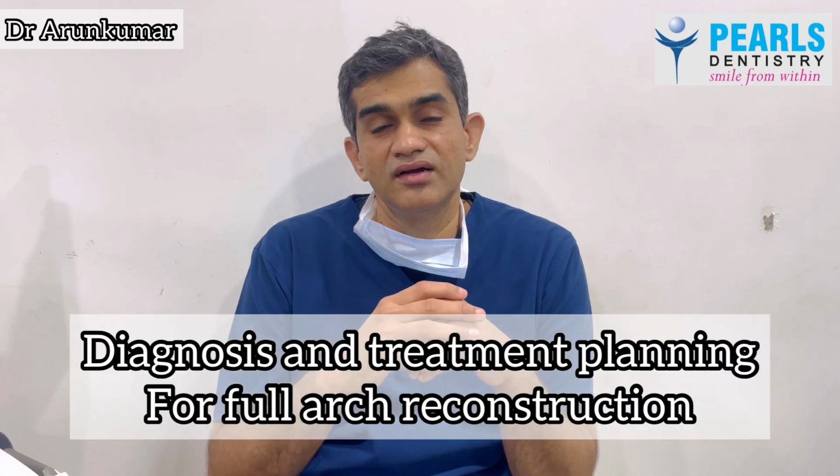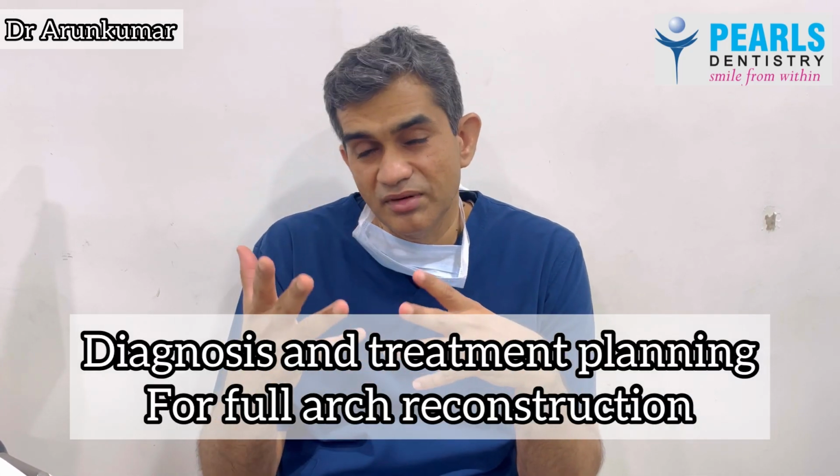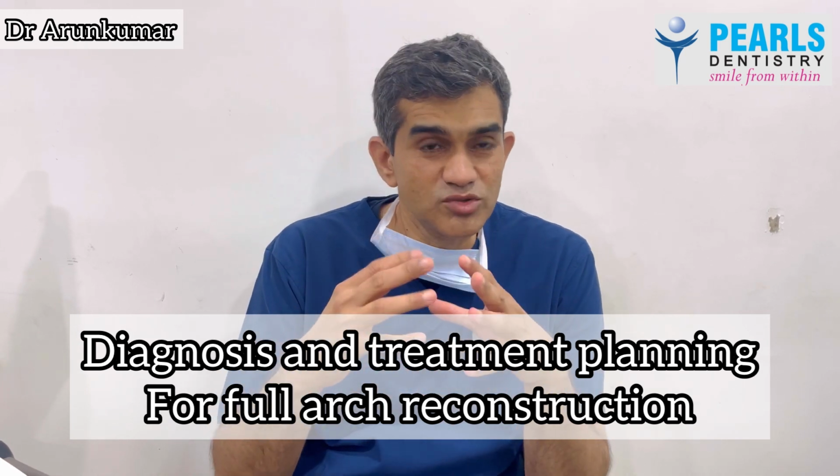So the importance of a comprehensive diagnosis and treatment planning, especially when it comes to full mouth implant rehabilitation, is what we were seeing in our previous video. So this video is going to be a continuation of that video. If you have not seen our previous video, kindly please watch it so that you will have a context of what we are speaking right now.